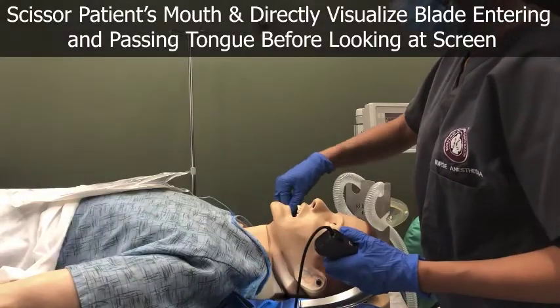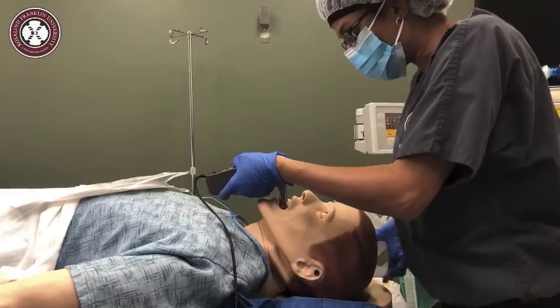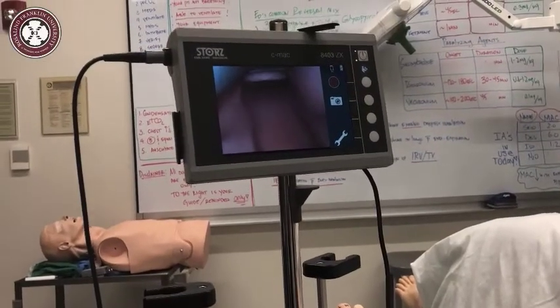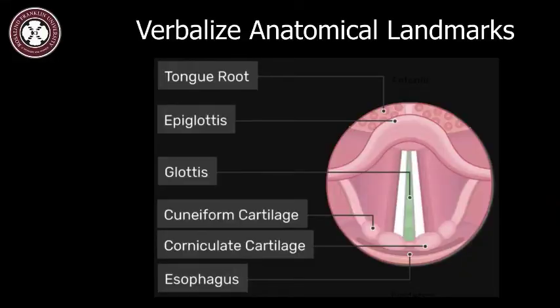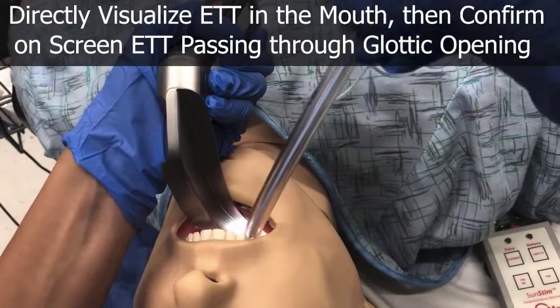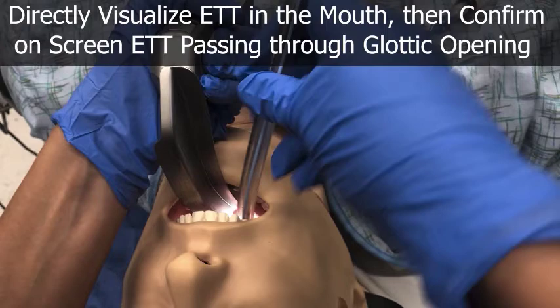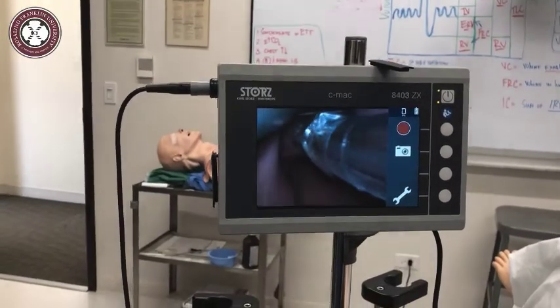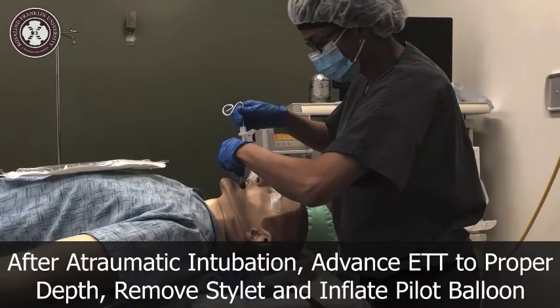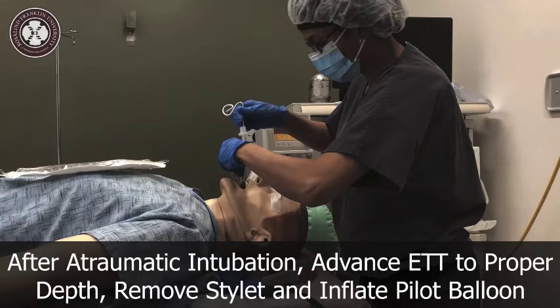With sufficient anesthetic depth and paralysis, scissor the patient's mouth and insert the VL blade midline. Directly visualize it until it's past the tongue before looking at the screen. With the tongue in the submandibular space, look for anatomical landmarks and be sure to verbalize them to your preceptor. Once the glottic opening is identified, carefully insert the endotracheal tube, again initially under direct visualization to avoid tissue trauma. Then look back at the monitor to confirm its passage through the vocal cords. After atraumatic introduction of the endotracheal tube past the vocal cords, withdraw the stylet and advance the endotracheal tube to a proper depth.